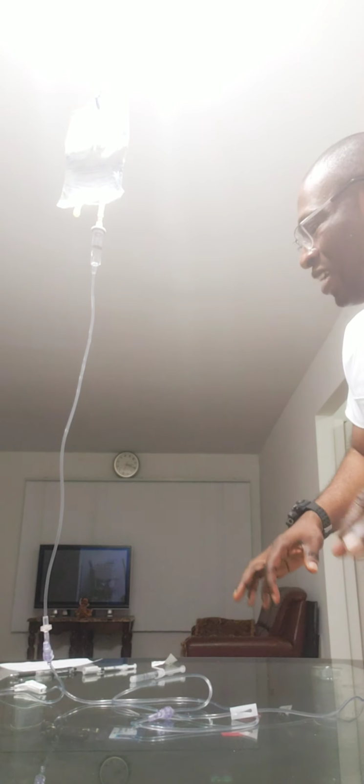After flushing, I have to assess my patient and make sure he's in order, check for adverse reaction for both the existing line and the IV lock. Then I go ahead and do my documentation: the right dosage, the right route, the right time, and the right medication administered to the patient. Do my hand hygiene. Okay, thank you very much. If you have any question, just call me, okay? All right, there's a call light.